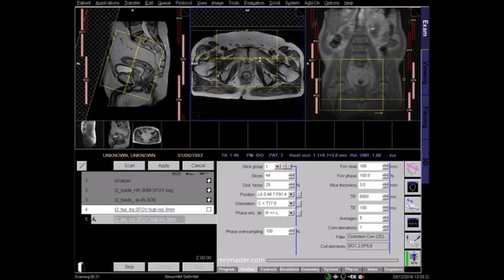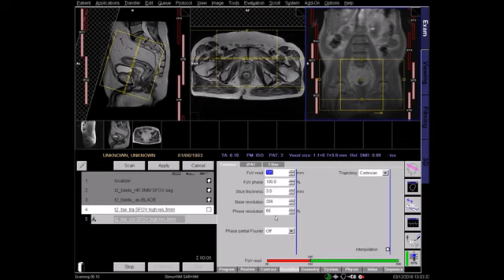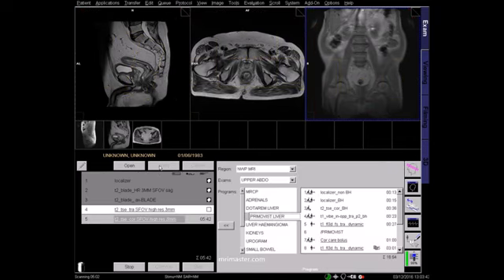Centre in the axial and coronal views. To reduce time, you could reduce an average or NEX or NSA, but as the signal has now dropped, you will need to compensate by dropping the phase resolution. Once the amount of signal is sufficient, you can apply.